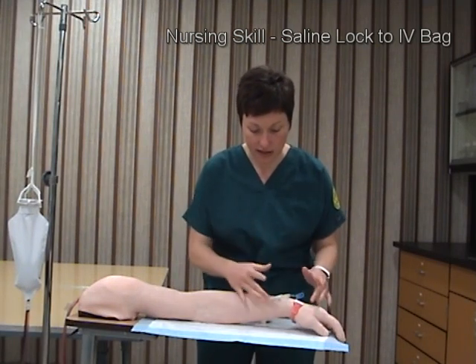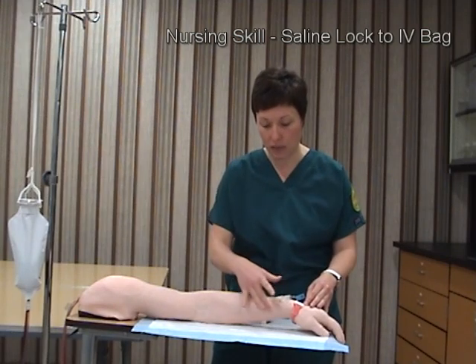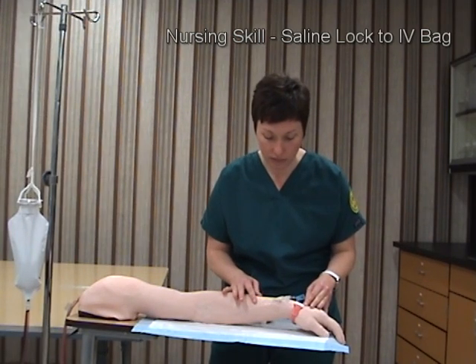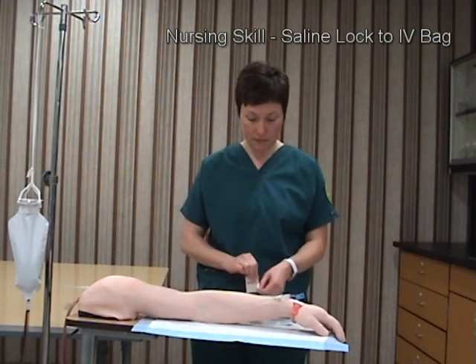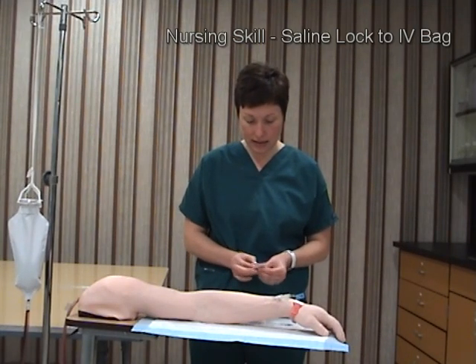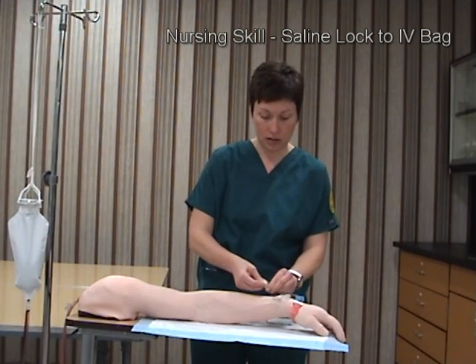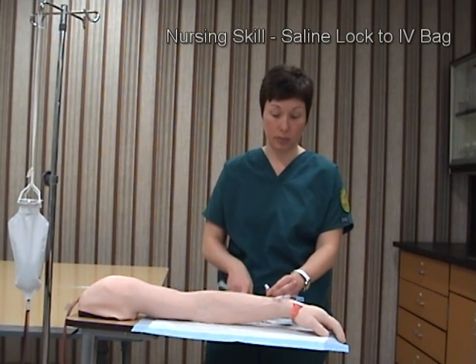The first thing I'm going to do is a visual assessment of the IV insertion site. This is in a saline lock, so I want to make sure there is no redness, swelling, or signs of infiltration, and that the patient isn't experiencing any pain. Everything looks good, so I'll begin by cleansing the saline lock port, giving it about 15 seconds for the alcohol to dry — otherwise it will burn when it goes in.